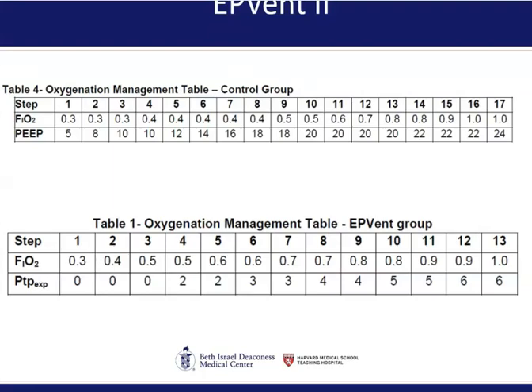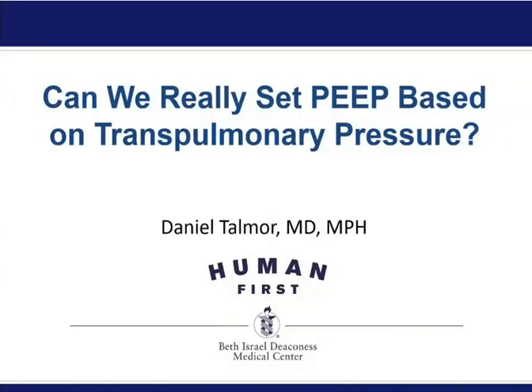principle, however, is sound and really should be obvious to all of us. Each patient is different. You need to look at each patient at the bedside. You need to think about the mechanical ventilation of each patient. And one way to do that is using esophageal pressure measurements and calculating transpulmonary pressure measurements. I am sure that in individual patients this makes sense. I'm sure also that it makes sense for us as a community to be thinking about individualization of care and not just lumping patients, responders and non-responders together into large trials.